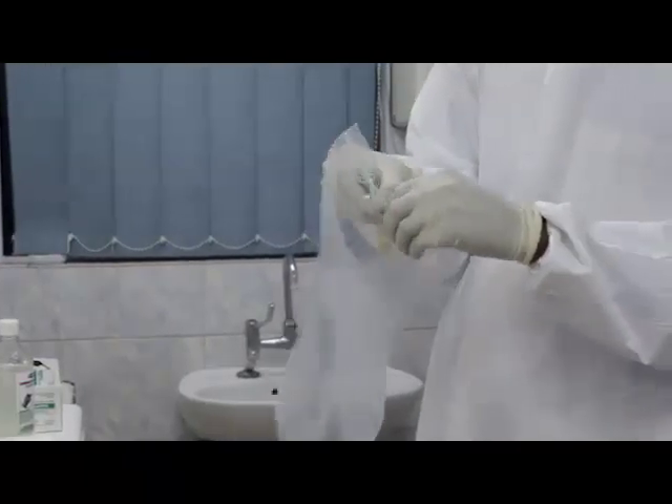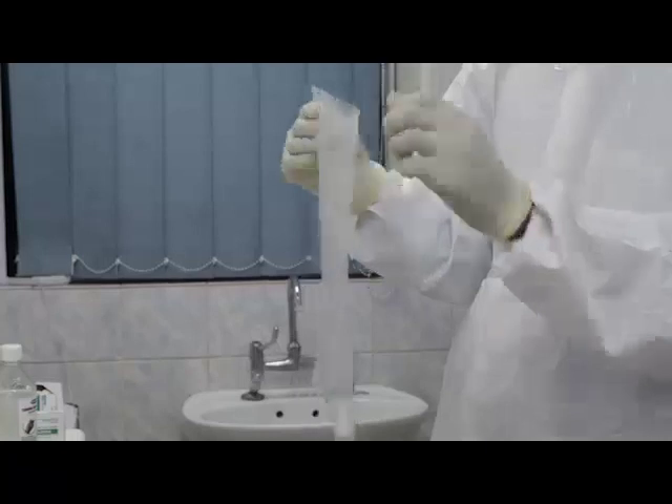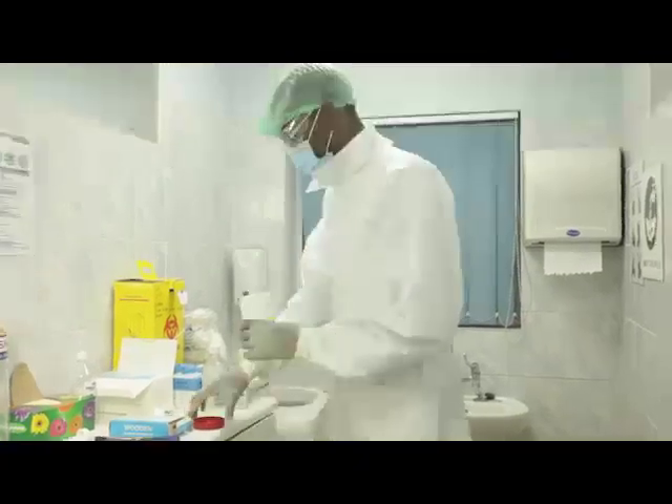Step ten, place the viral transport media vials in a ziplock plastic bag. Step eleven, place the ziplock bag with the specimen viral transport media vials into the secondary specimen container.